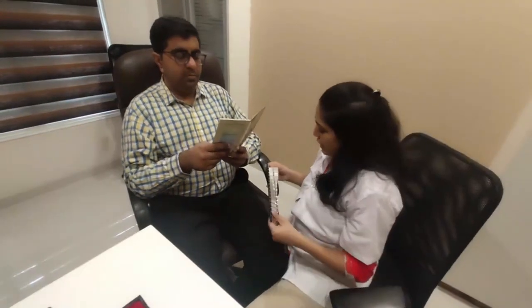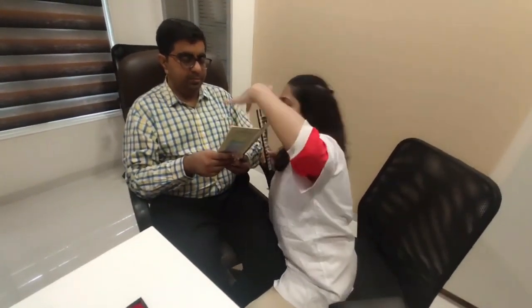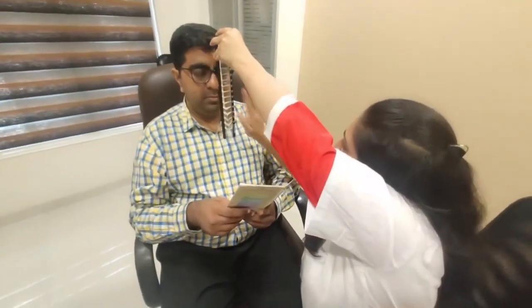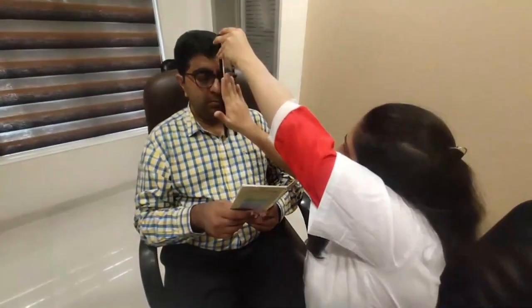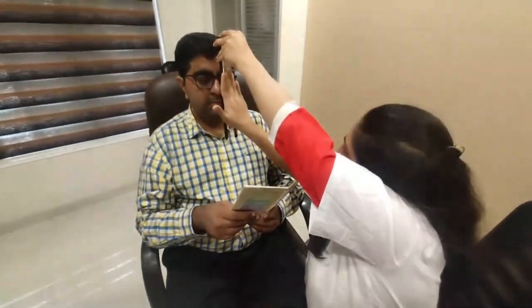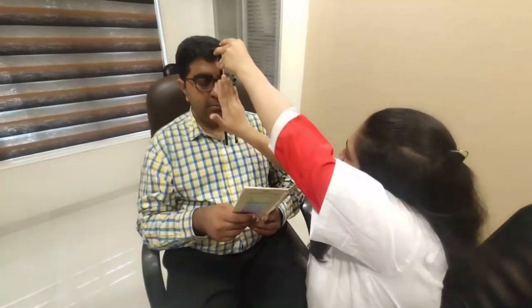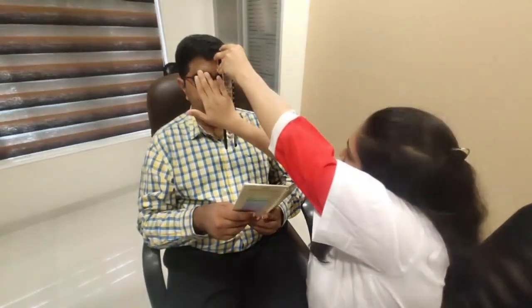Now let's see with the glasses. Please look here at the word. Okay. With the glasses, the patient has got a deviation of 8 prism diopters.